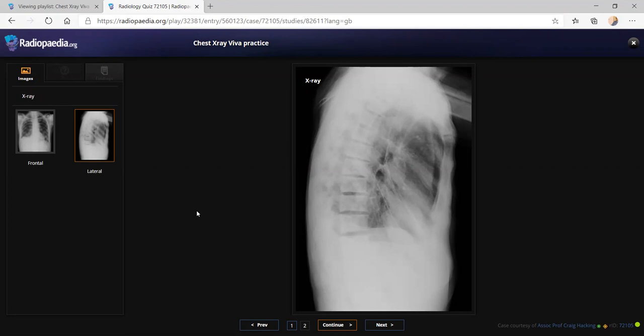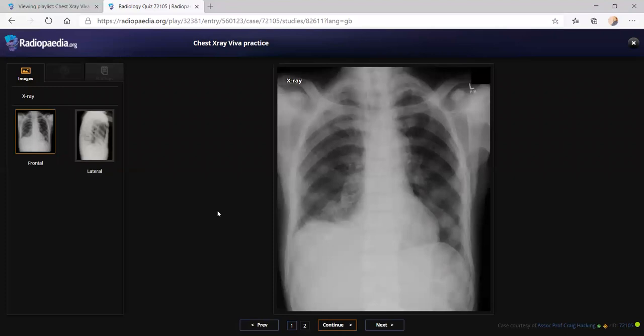So the other thing is, I would like, I mean, there is increased sclerosis and these appearances. My top differential would be sclerotic metastatic disease, and prostatic. The prostate would need to be one of the primaries which causes these appearances. To take this further, I would inform the referring clinician and, for appropriate management, include CT chest abdomen pelvis and also MRI of the prostate. Urological team review.